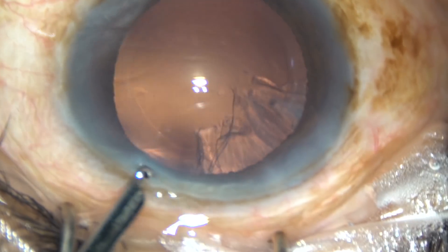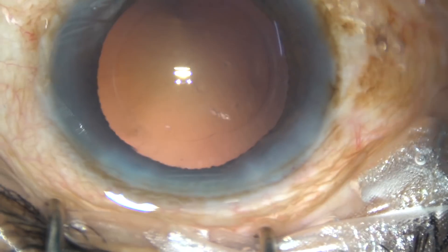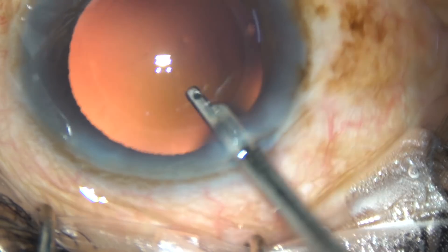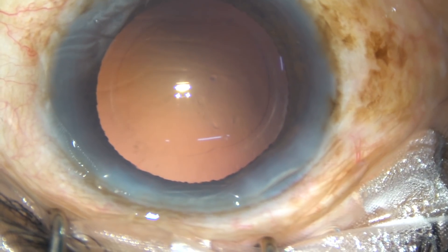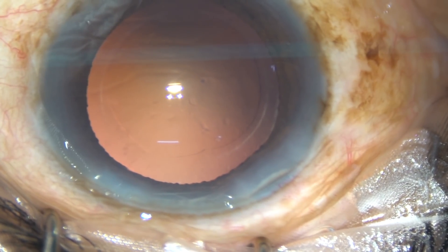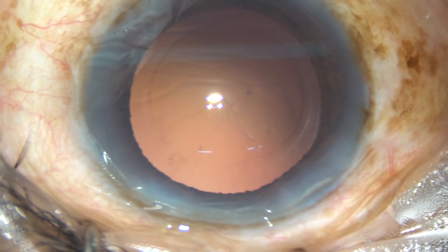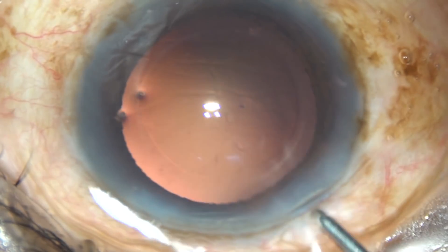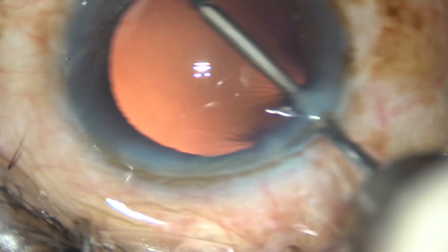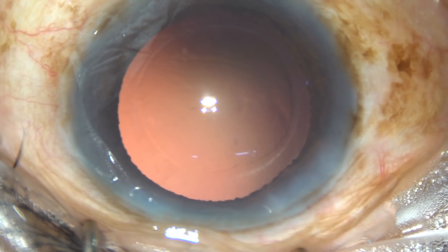Why should we do some cases like this? Because in some cases you will find that hydro-dissection is not at all good and the nucleus is not rotating nicely, and you will be very afraid if you don't know this technique. So this is a very simple technique — just chop the nucleus into some fragments, remove those fragments, and hydro-dissection will occur naturally. You can manage the nucleus like this. Now this is hydro-polish, and the posterior capsule is very clean.